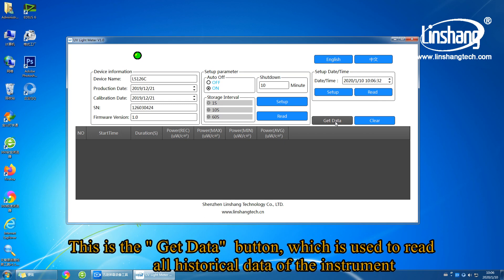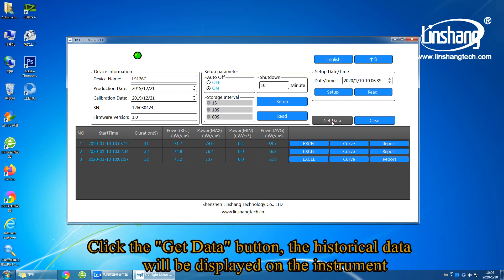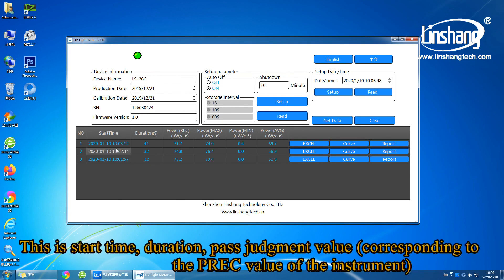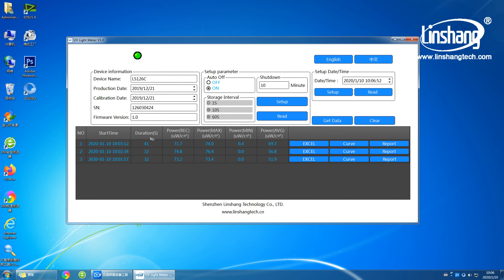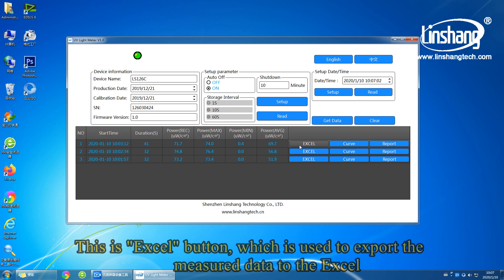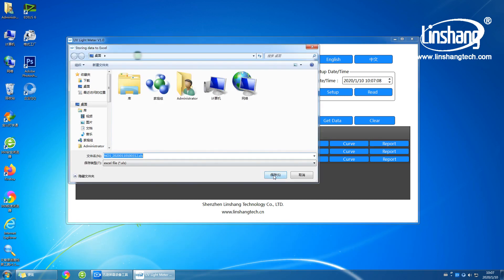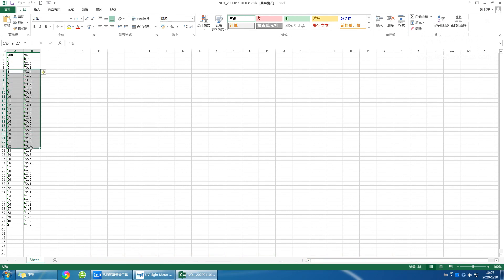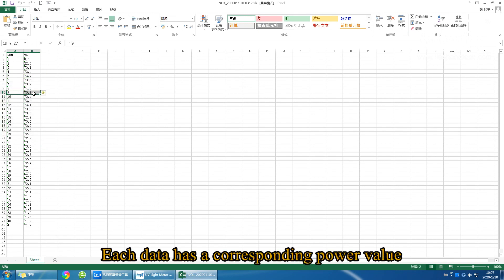This is the get data button, which is used to read all historical data of the instrument. Click the get data button and the historical data will be displayed, including start time, duration, pass judgment value, maximum power value, minimum power value, and average power value. This is the power value. This is the Excel button, which is used to export data to Excel. Each data entry has a corresponding power value.